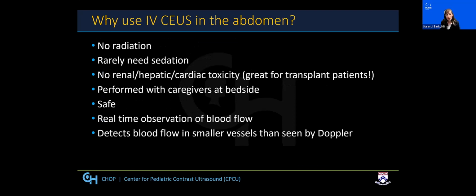Why would we choose to use contrast for children and within the abdomen? Well, it shares many of the benefits of ultrasound itself without radiation, not needing to sedate children. It's a safe application, which you'll hear shortly from one of our colleagues. We can perform these examinations at the bedside. We can travel to intensive care units, potentially into the emergency department.